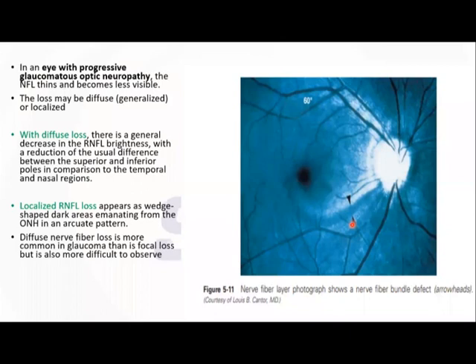They will not continue with the disc margin, and it will be correlated with the rim loss. There can be visible RNFL defects which are physiological also. A visual field defect will mostly not be there in that case. The only thing is it should correlate with the rim loss and continue with the disc margin.